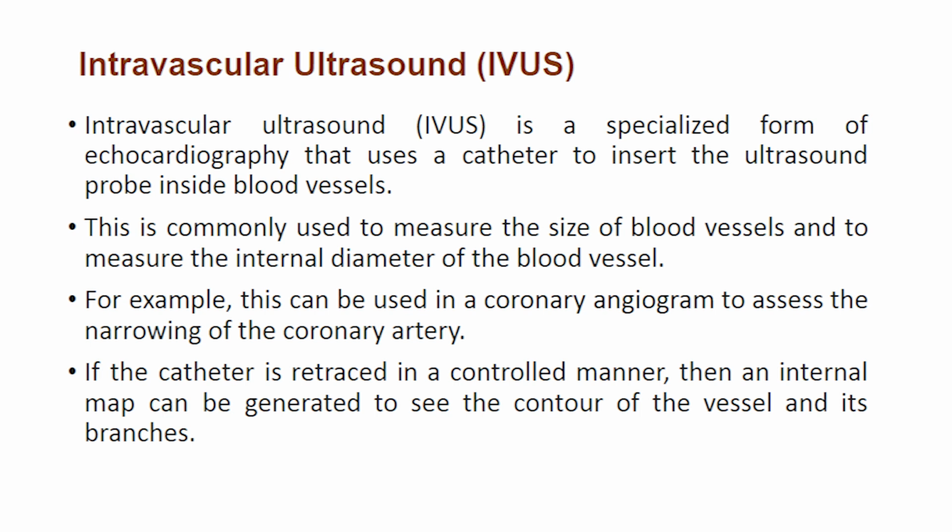If the catheter is retracted in a controlled manner, then an internal map can be generated to see the contour of the vessel and its branches.